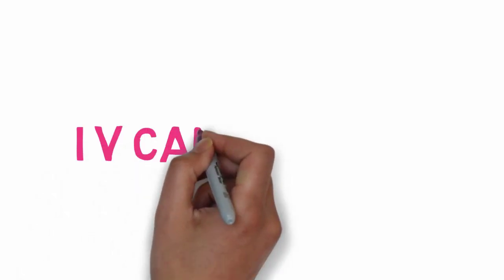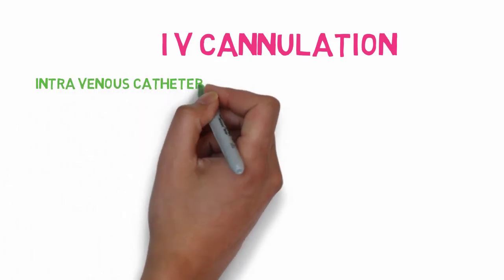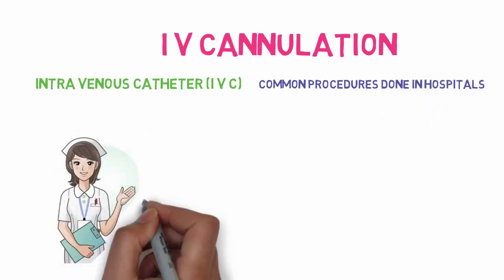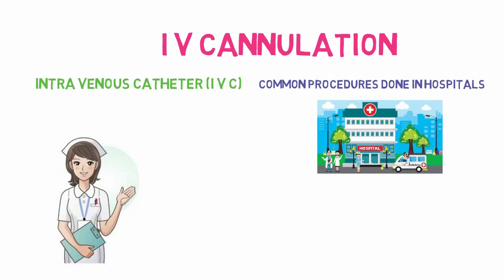Hi friends, we will discuss IV cannula insertion, also called intravenous catheter insertion. It is one of the common procedures done in a hospital setup. Most hospitals prefer to have an IV cannula for all their inpatients, because at the time of a medical crisis, it will be helpful.